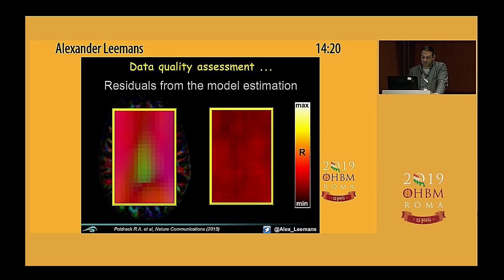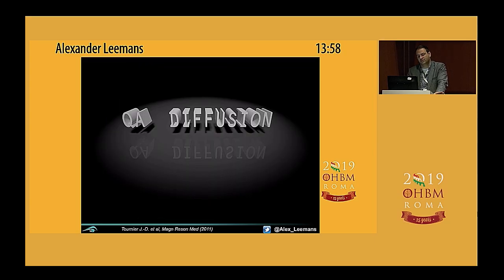So yeah, he has what we would maybe call a hyperplasticity or an unusual configuration of anterior-posterior pathways smack in the middle of the corpus callosum. By the way, this is not partial voluming with the fornix below or the cingulum bundle above. No, this is the middle of the corpus callosum. So anyway, take-home message: QA of diffusion, and this is mainly at the stage of looking at your data and looking at the residuals. Both are kind of qualitative, but you can further standardize this. But it's very important to do it, especially if you're embarking on a new study. Make sure you do a few pilots.